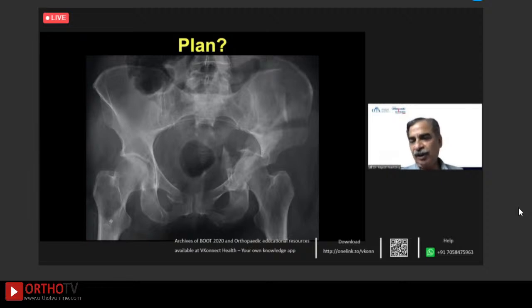However, I think what is equally important here is to fix the ilium, because in many cases I think it's preferable to start restoring the anatomy from where it works the best, and in any case to deconstruct the entire acetabulum, start fixing from the ilium, and fix anteriorly. And even if you wanted to do a primary total hip in this, you would have to fix the fragment. It's not something I would get away with. I would need the fracture to be fixed, and if the head is too damaged, put the plates in and then do a joint replacement. So fixation has to be done still.